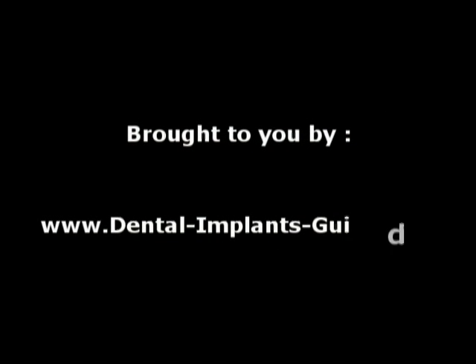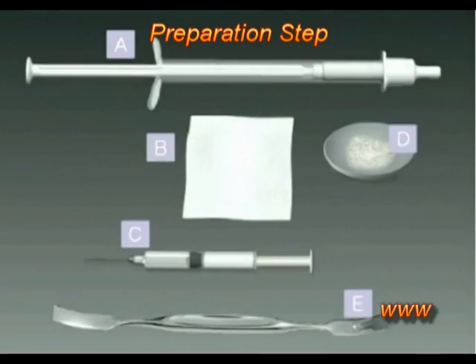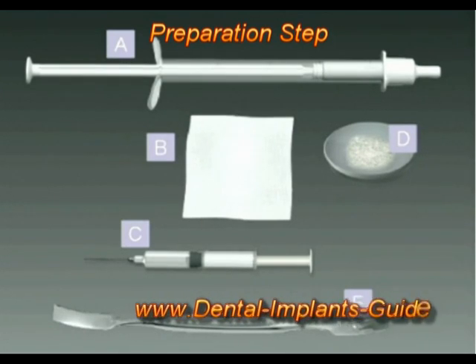This video is brought to you by DentalImplantsGuy.com — best online info. Composite Graft with Bond Bone Preparation Step.